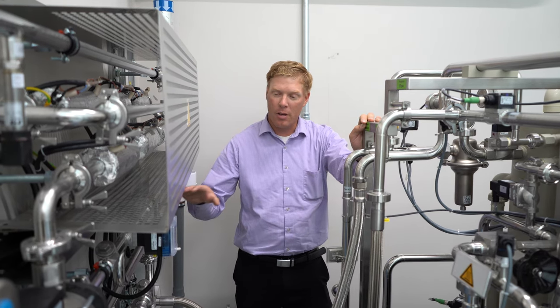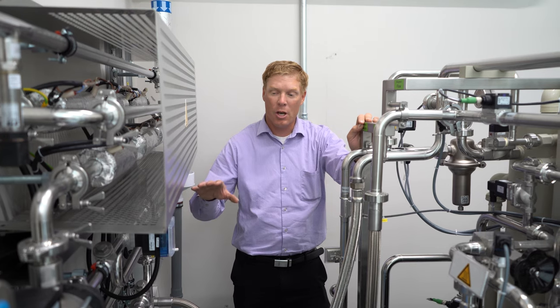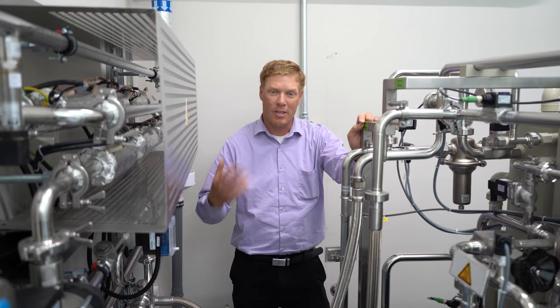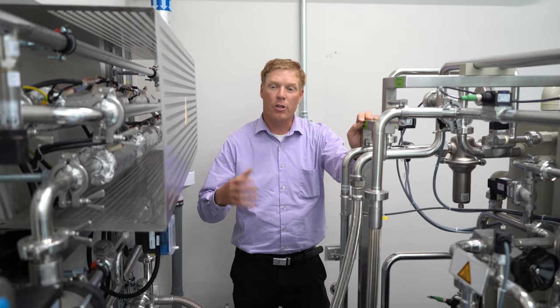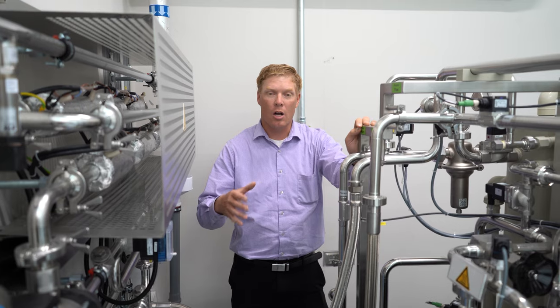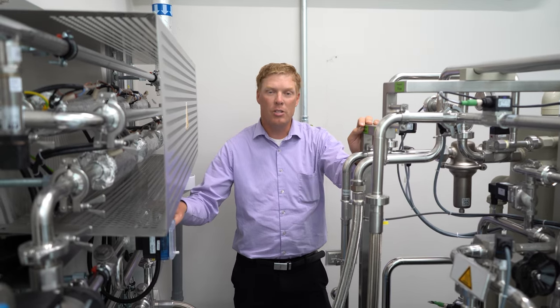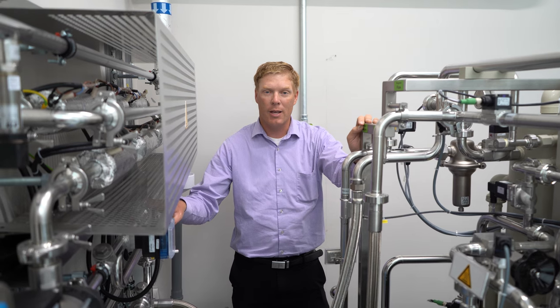We also have the disinfection system on this side. This is a very new system — our old systems used chemicals to disinfect, and then you would have to clean out and verify the chemical was gone so we wouldn't cause harm to the patients. This new system uses heat disinfection, which is much safer for the patients.